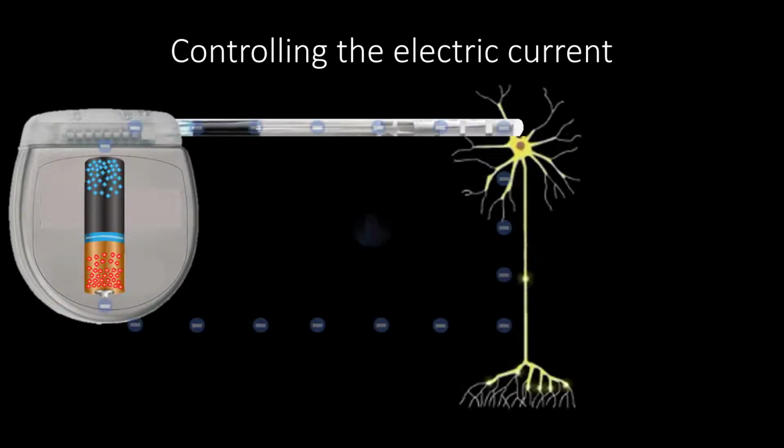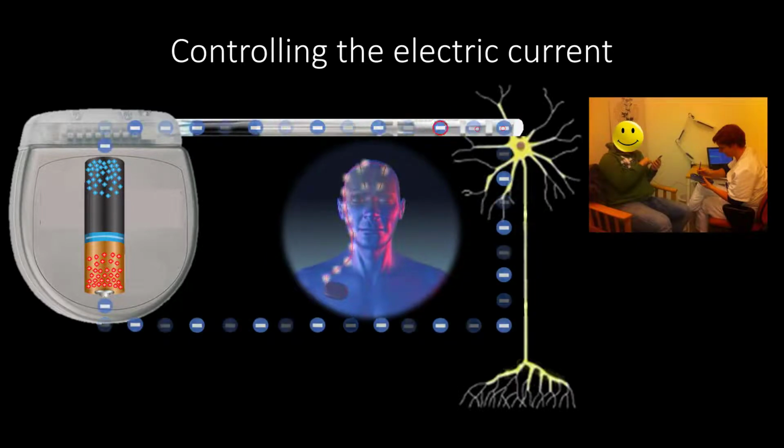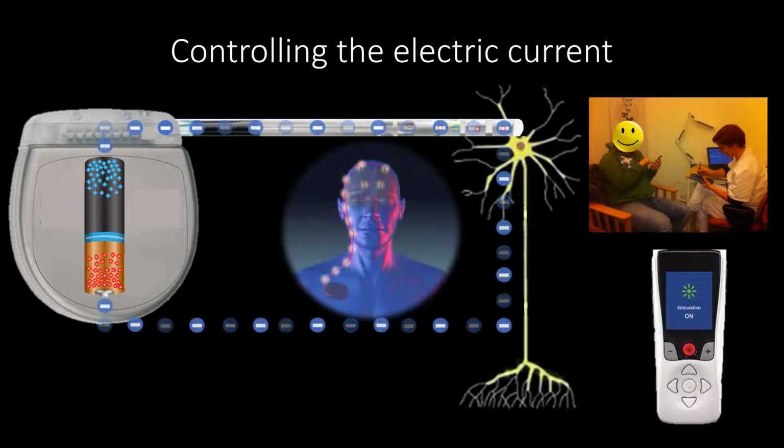The stimulation can be started with an external programming device directly when the patient has recovered from surgery, but often the start is delayed, typically by about 4 weeks, to avoid influence from the microlesional effect, that is the edema surrounding the electrode immediately after surgery. The patient is further equipped with a remote control with which they can control the stimulation, check the battery level, and sometimes make minor adjustments of the stimulation parameters.